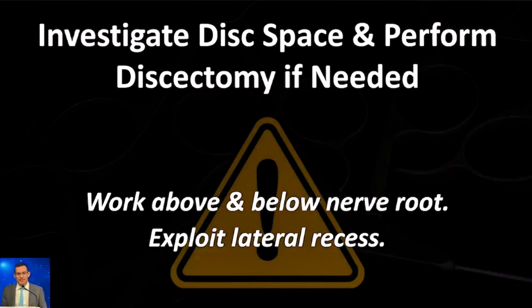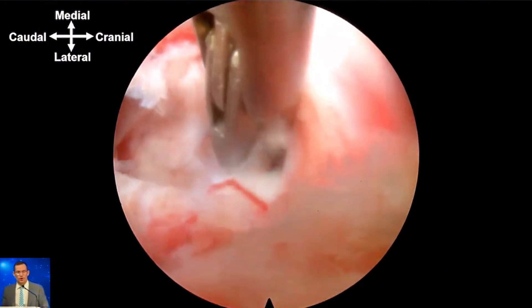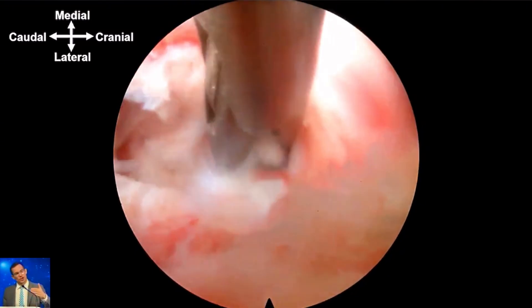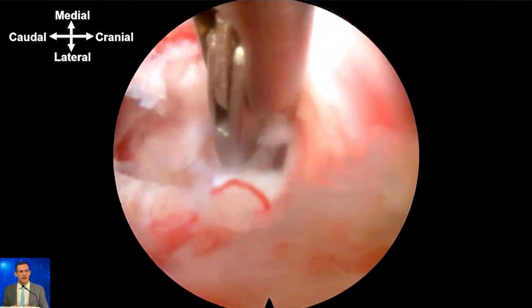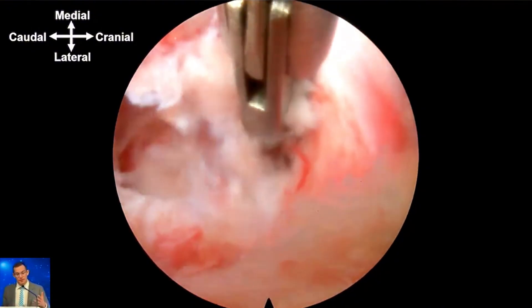If there's a disc herniation, as in this case, you can start to investigate the disc space. There's no dogmatic approach — I just see what it gives me and which side is easier to access. Oftentimes I'm going back and forth above and below the nerve to make sure I've gotten all the disc material out. The lateral recess, just medial to where the foramen starts, usually has a little more space where you can get your instruments in and then slide them laterally to reach disc material in the foramen itself.